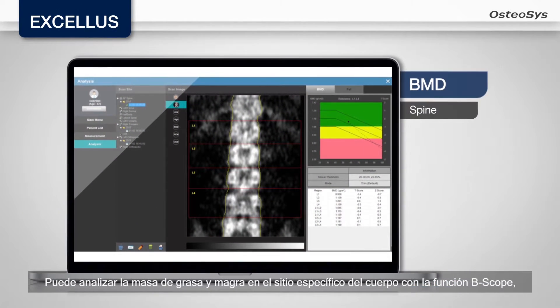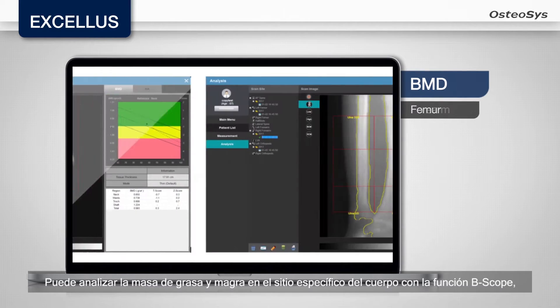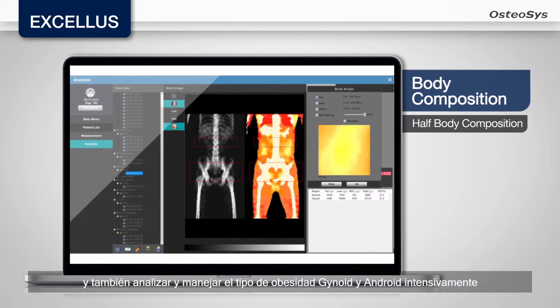With the Osteosis-exclusive B-scope function, you can scope fat and lean mass in a specific side of the body. It is also possible to analyze and manage intensively the gynoid and android area.